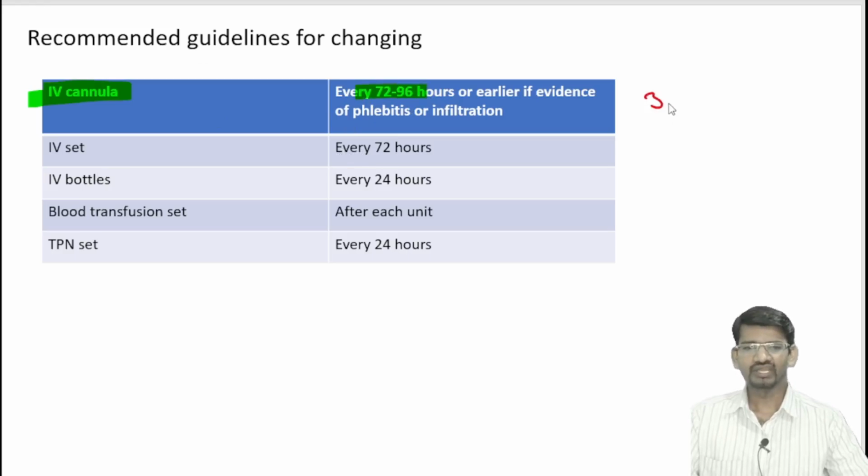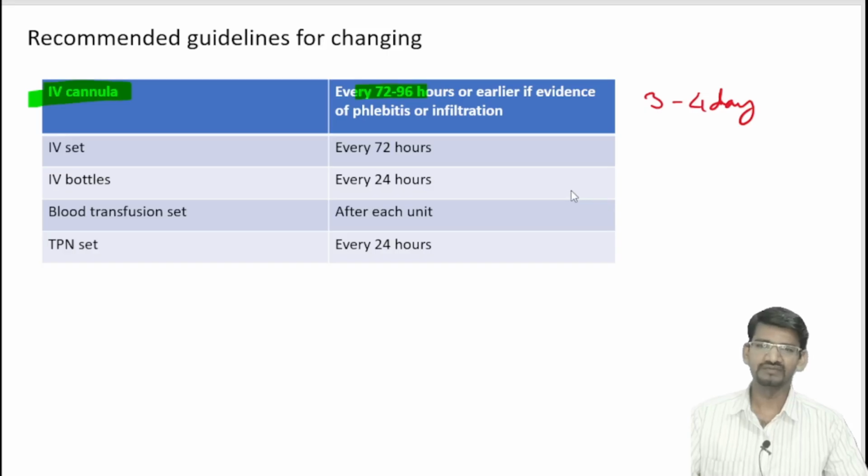we have to change the cannula, or change the site of the cannula. We have to remove the old cannula and relocate it into a different area. Or else, even earlier than 3 to 4 days, when there is evidence of phlebitis and infiltration.